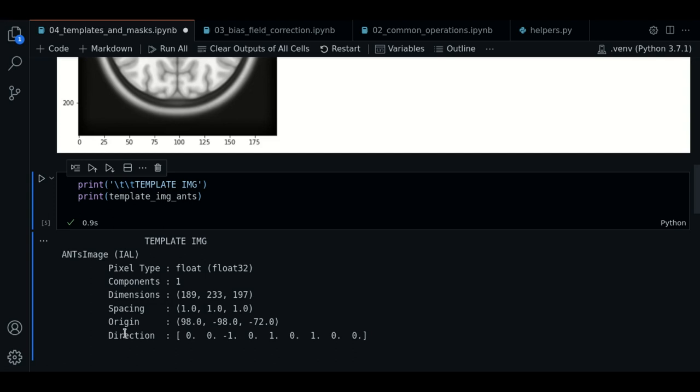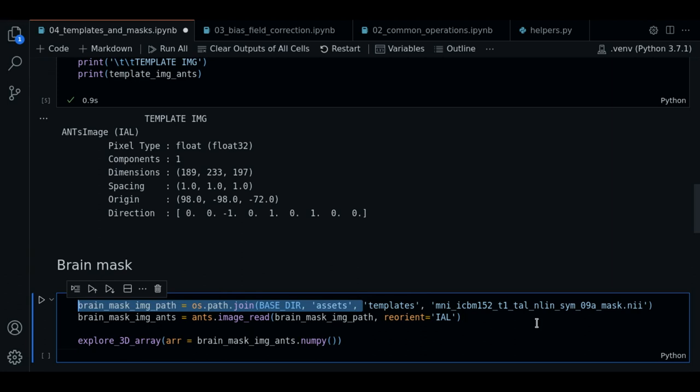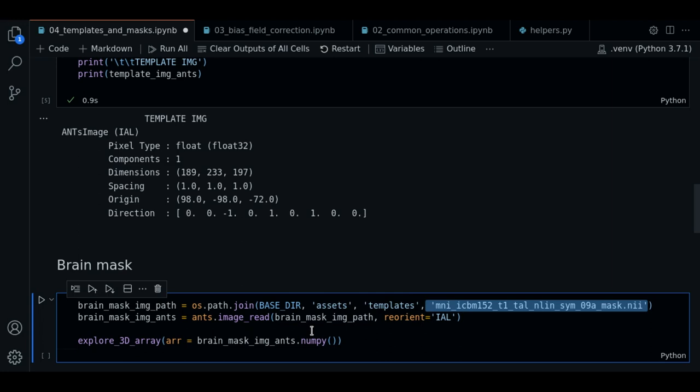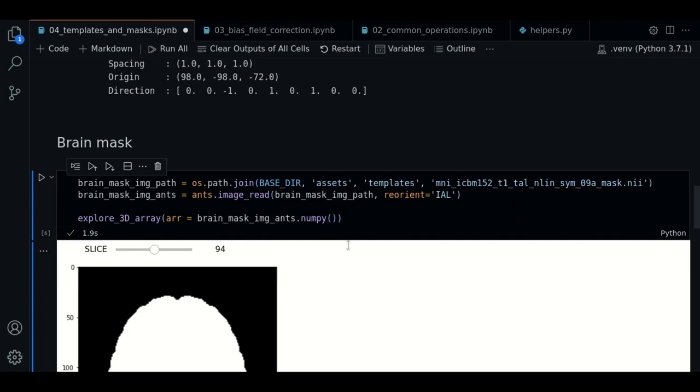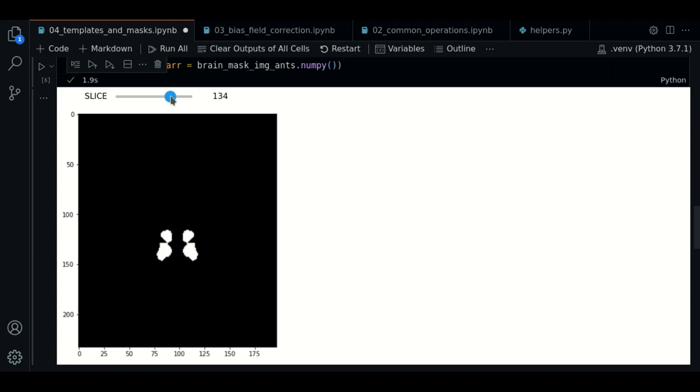So now let's load our brain mask. Our brain mask is in the same folder as the template. And we load it in the same way as we do with the template. So let's execute, and let's see how this looks like. There we go. As you can see, we have a brain mask of the template that we just saw. It looks well-shaped too.